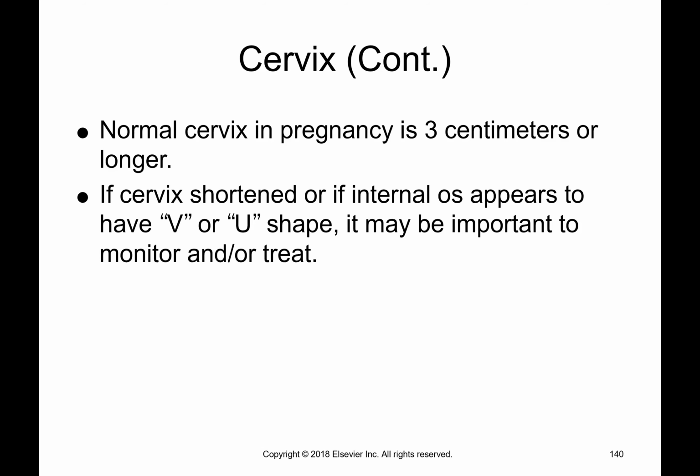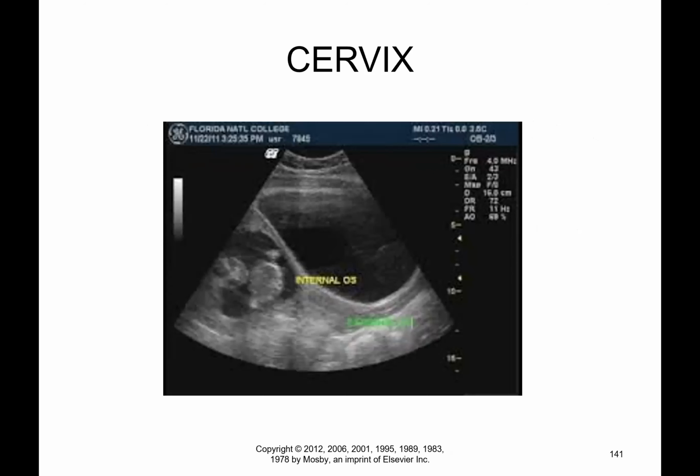Again, I think we will talk about this later on in a different chapter, but this is the bladder, and then this is the cervix, with the baby there. And that's a transabdominal view.